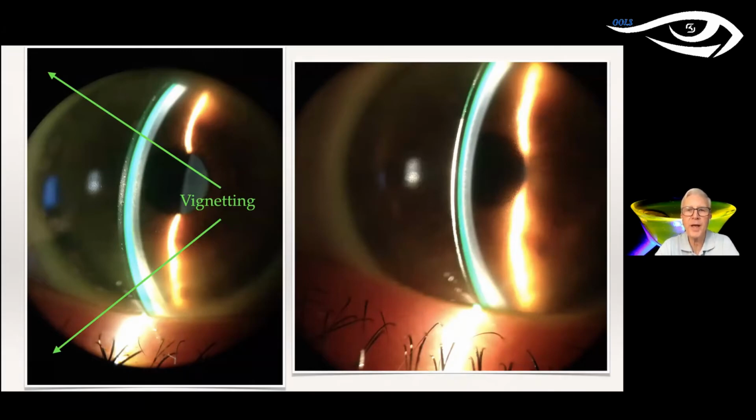The way you get that in a smartphone is when you look at the image on the left, how we take our fingers and either spread them to enlarge the image or bring them together to make the image smaller. We do that to change the magnification on the screen face of our smartphone. Well, what you want to do when you take these pictures is bring this up.